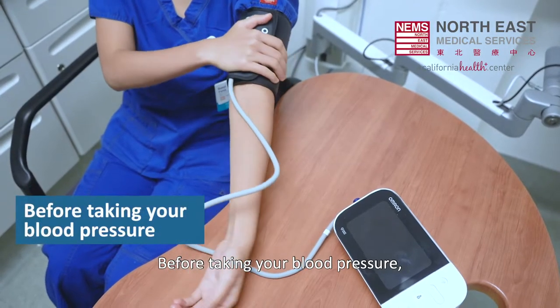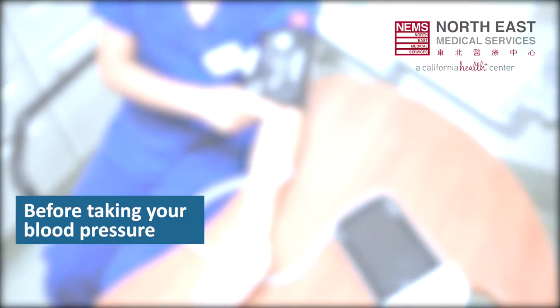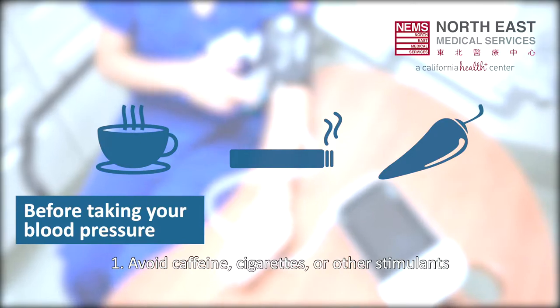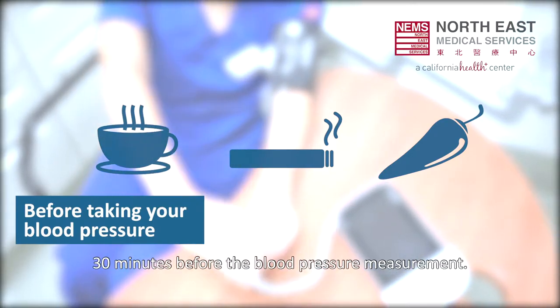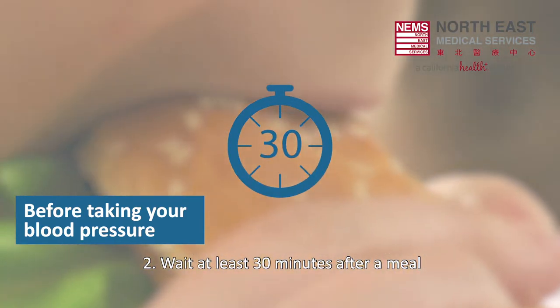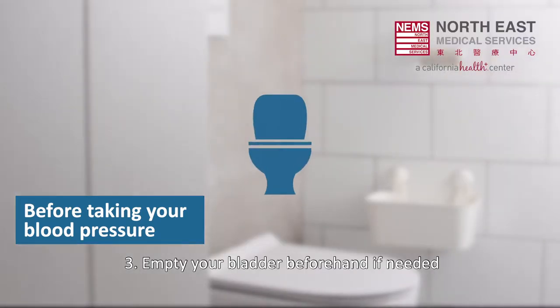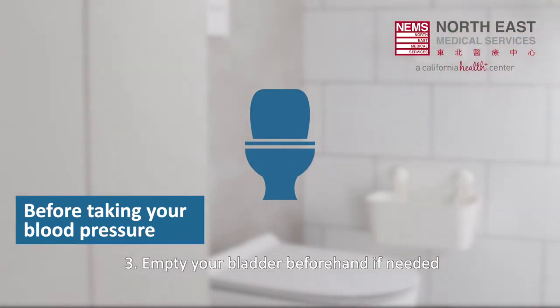Before taking your blood pressure, follow these steps to ensure an accurate reading. 1. Avoid caffeine, cigarettes, or other stimulants 30 minutes before the blood pressure measurement. 2. Wait at least 30 minutes after a meal. 3. Empty your bladder beforehand if needed.